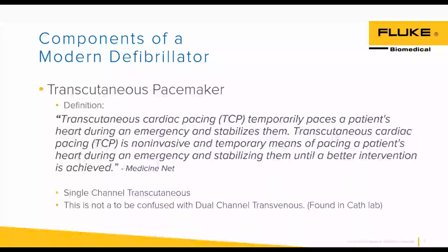So transcutaneous pacemakers. Real quick, there's two kinds of pacemakers that we see a lot. There's transvenous pacemakers, the ones that are going to have leads implanted into your heart or into the vein. These are transcutaneous. These are the ones you find in a defibrillator, meaning it's going to go in across the external patient's chest, so across the skin.